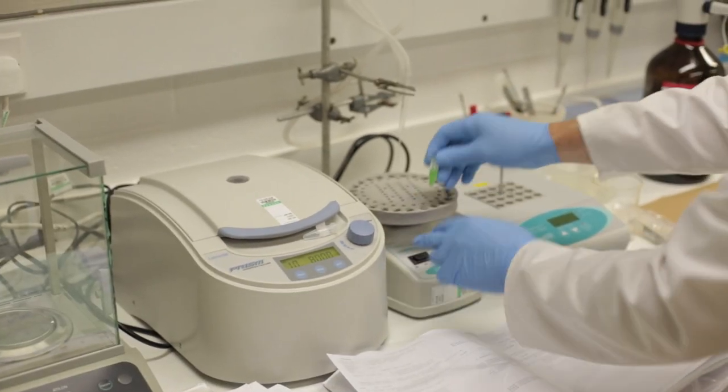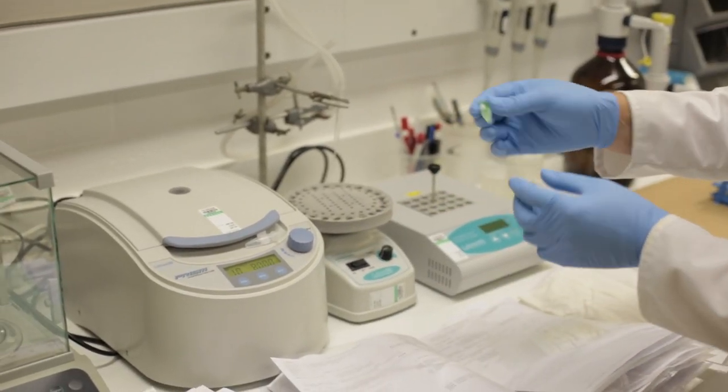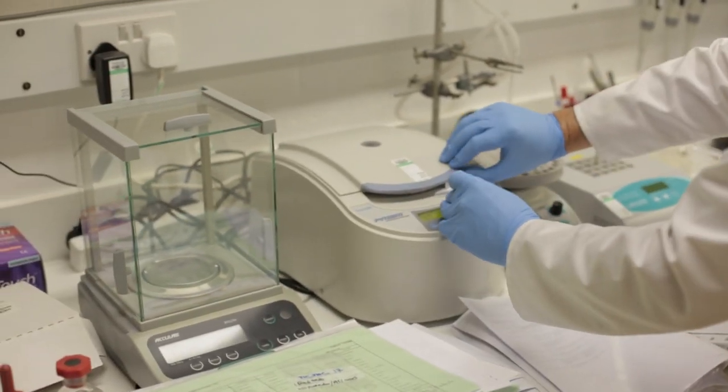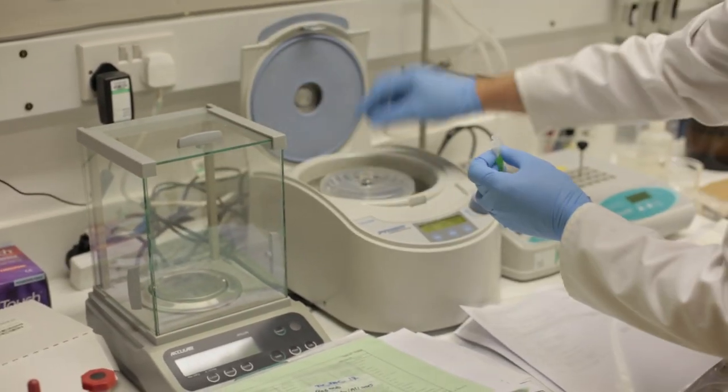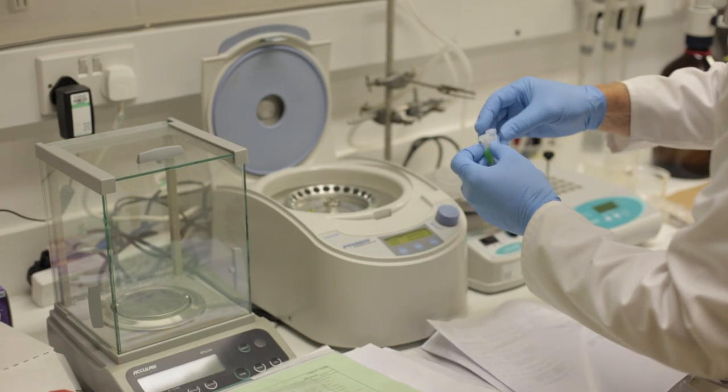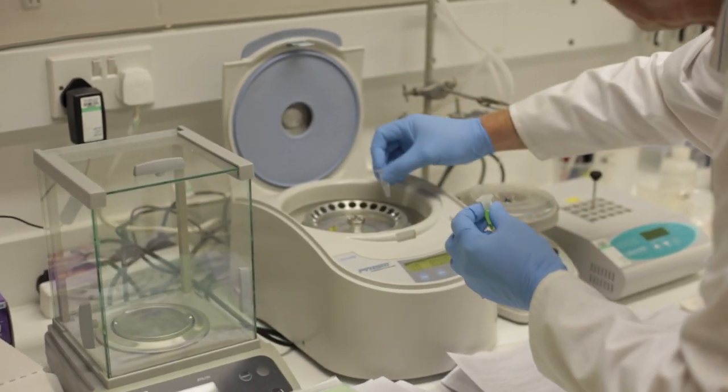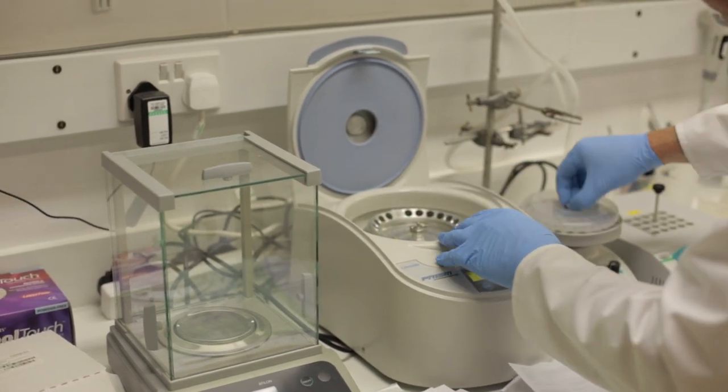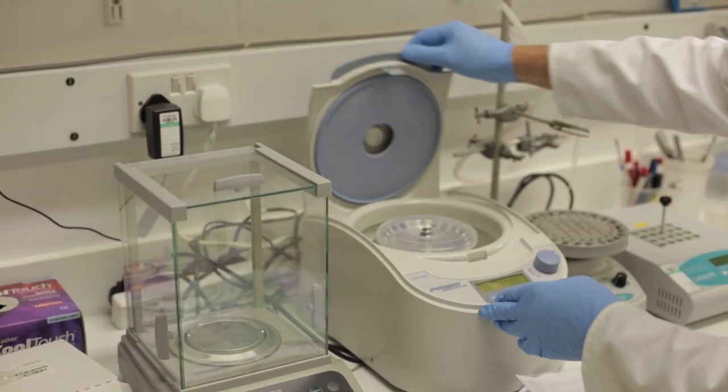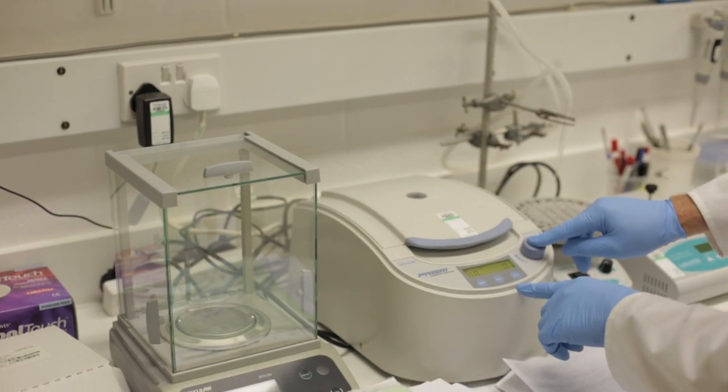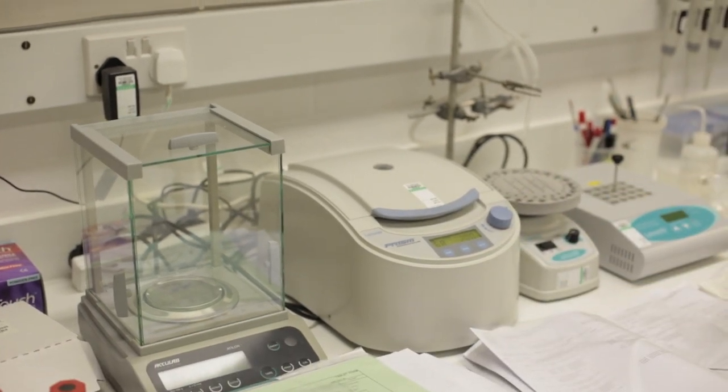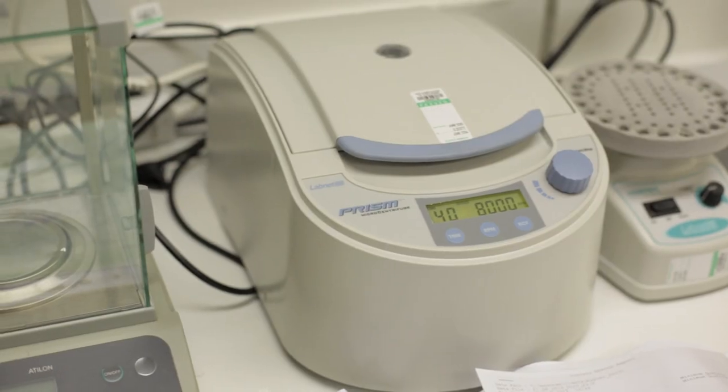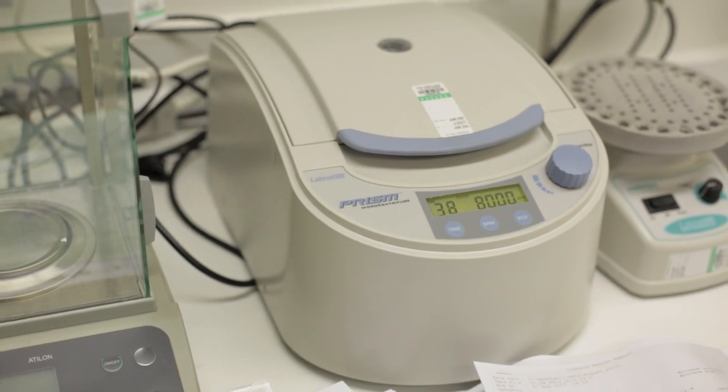So that's now disintegrated the tablet and extracted the drug into the methanol. Now we're going to put it in a centrifuge which will separate the methanol from the residual powder. So it goes in the centrifuge with a counterbalance, close the lid and it will spin for about a minute. So it's spinning at 8000 revs for a minute.